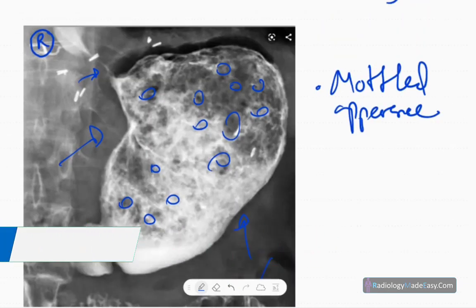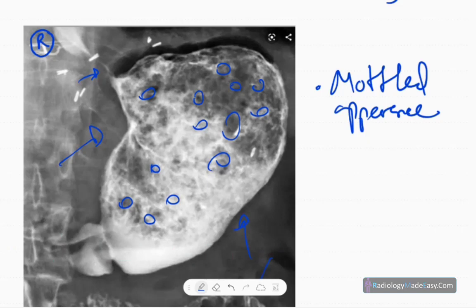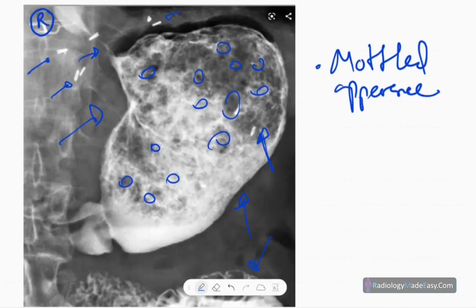No leakage of contrast, no fistula tracts, and you see some linear opacities here. So there's evidence of previous surgery in this patient. No bone abnormalities.